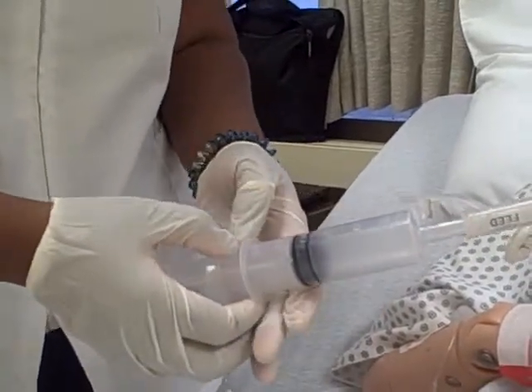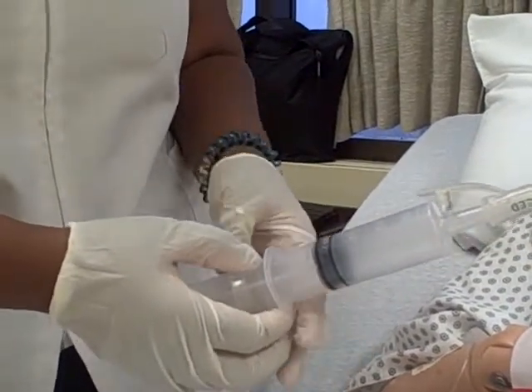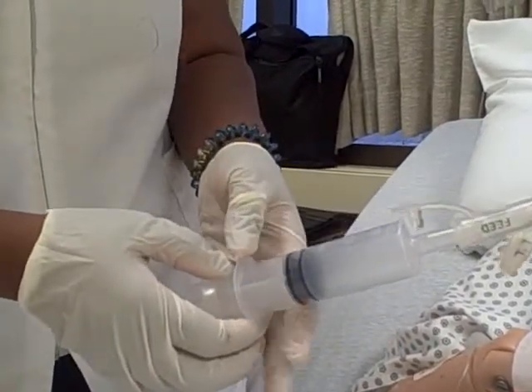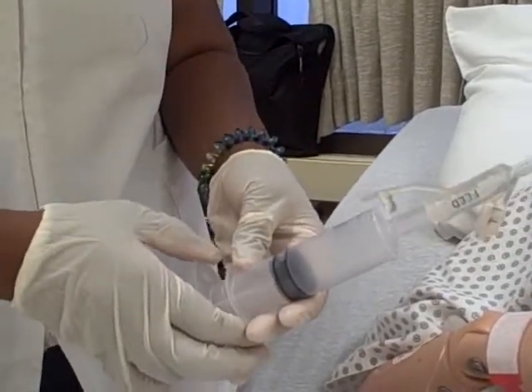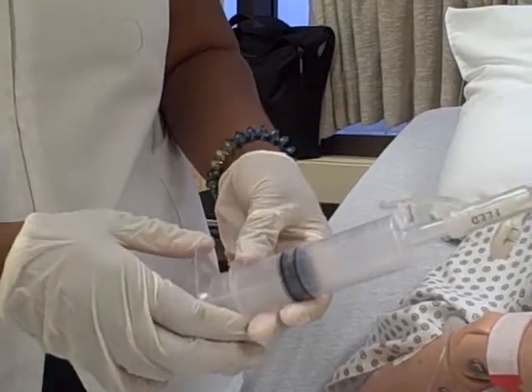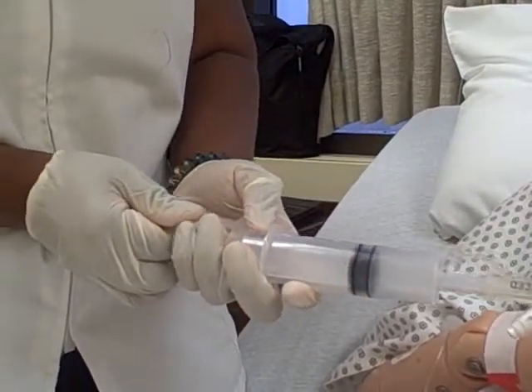And in the event of receiving more than 100 cc's of gastric contents in the syringe, I want to discontinue feeding. I want to discard the contents and notify the physician. But in this case, we have received approximately 40 cc's of gastric contents. So I want to reinstill it into the patient by pushing on the plunger.